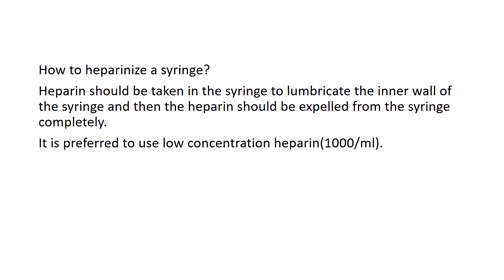Okay, and it is also important, when you take the sample, to immediately go and do the reading. Don't hold it for long, because if you hold it for long, again the report will be erroneous. And if you happen to have to hold it for long, in that case you have to keep it at an ice cold temperature.